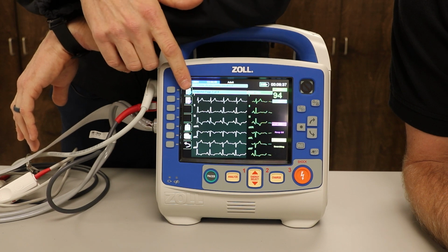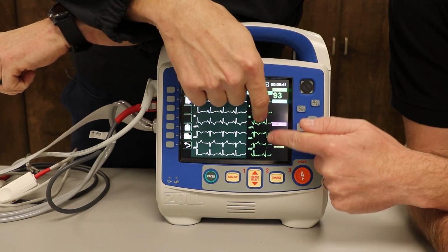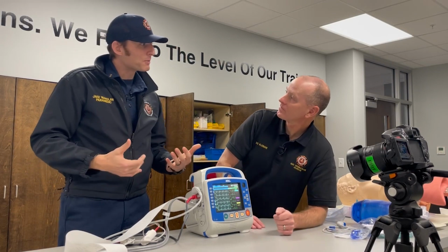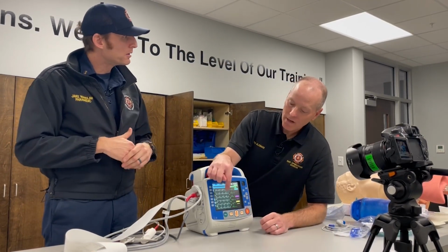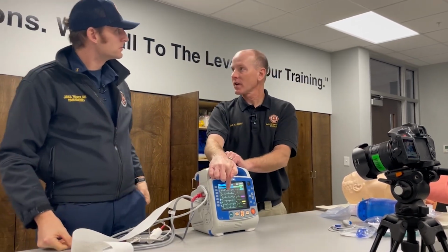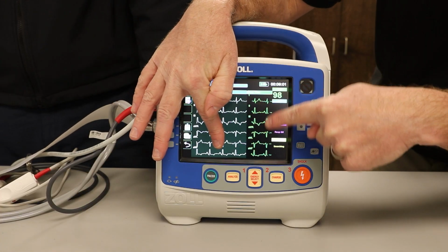This is actually going to give you a side-by-side of what the patient is. So if you look at this one that's actually moving, that's a live feed. That's what's going on at the moment. This is what we previously did. So if we're on scene for a long period of time with someone who's having a cardiac event, is that important to see where they were to where they are? Well, it is. If we had somebody who was having an LAD, and so we're looking at massive high lateral elevation, we could actually see this here. We're giving them nitro, and we can actually see the elevation disappear.